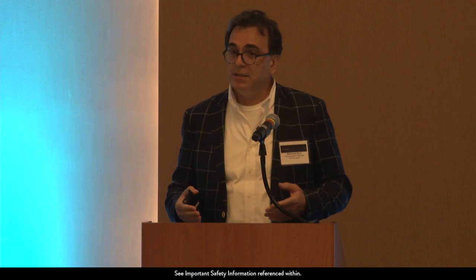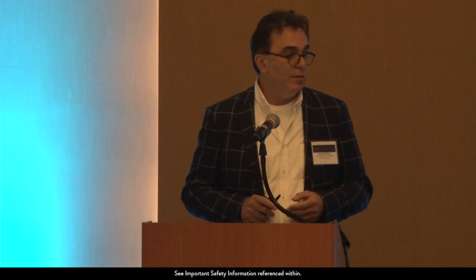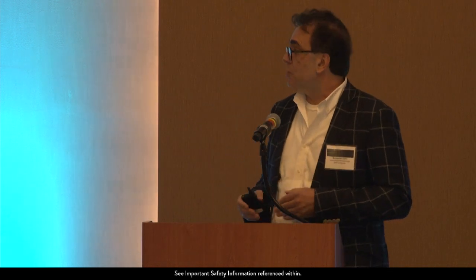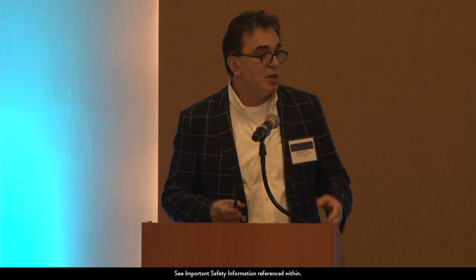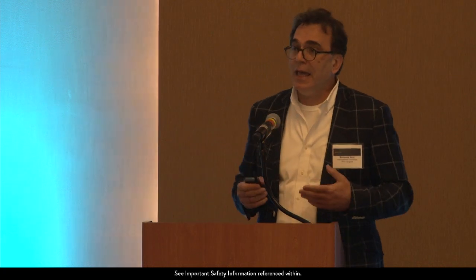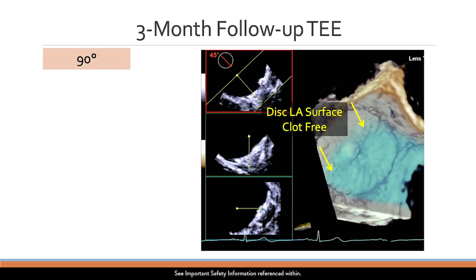So inside there is a tissue organization, and also the disc is almost on top of the left atrial appendage. That decreases the chance of device-associated thrombus at the LA surface of the device. So even if I don't put the color here, I already know that the leak is very unlikely, and my suspicion for device-related thrombus is low. It's even easier if you look at the 3D, you look at the en face view, you see the threaded insert in the middle, and there is nothing to tell there is a thrombus. So this is free of clot.